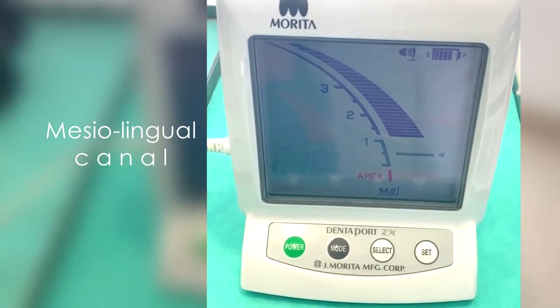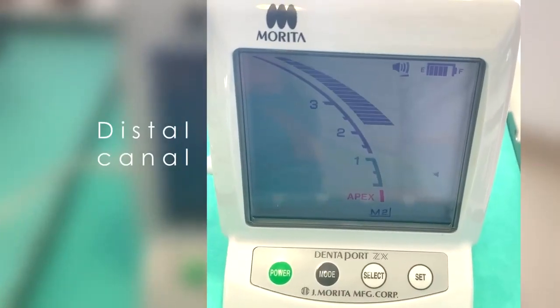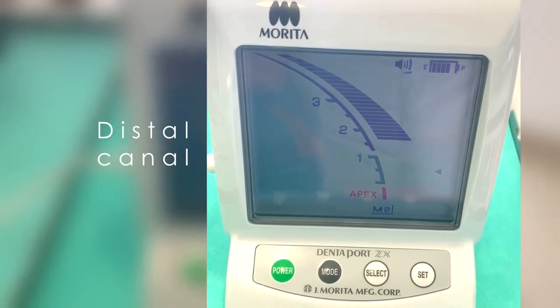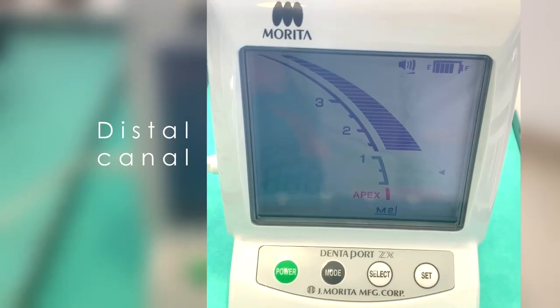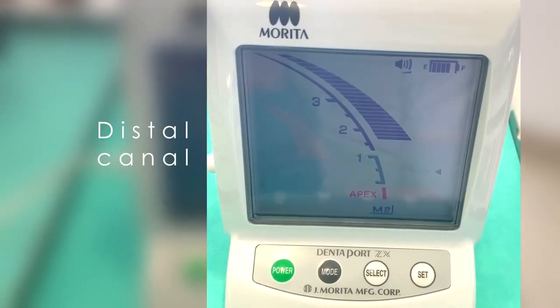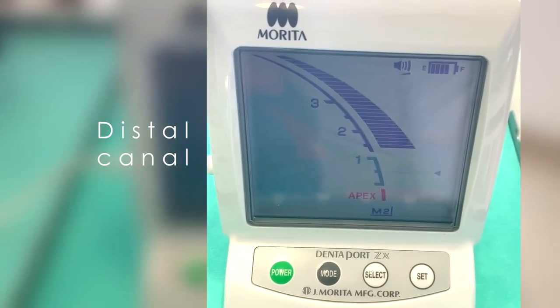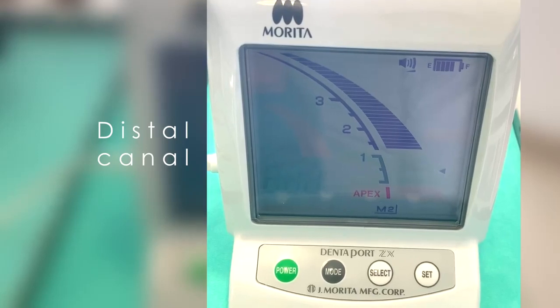Contrary to what is recommended by many clinicians, you don't need to go with your instrument to the zero reading point, located at the middle of the green scale or to the pink scale. And if you do so, you are in the foramen, which means you are beyond the limits of the canal, in the periodontal ligament space.